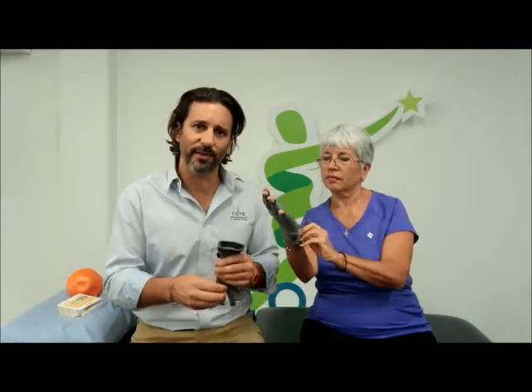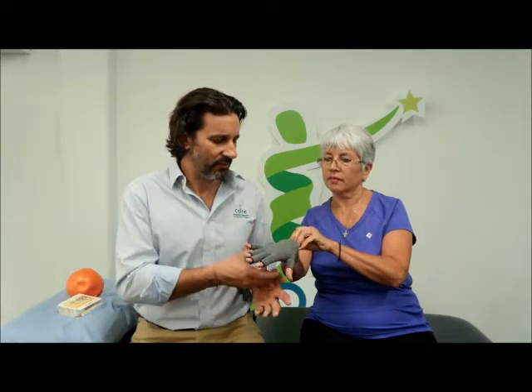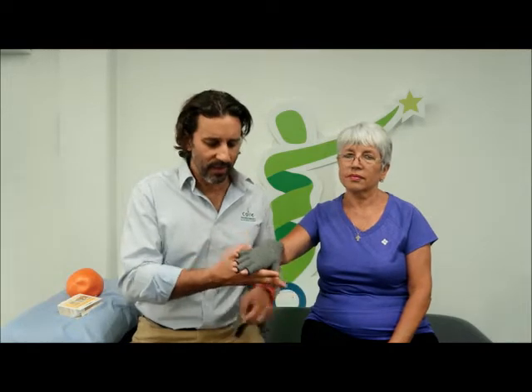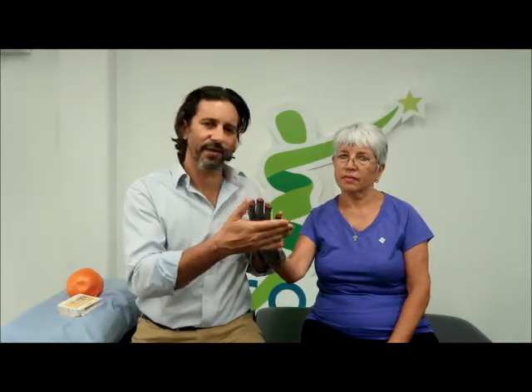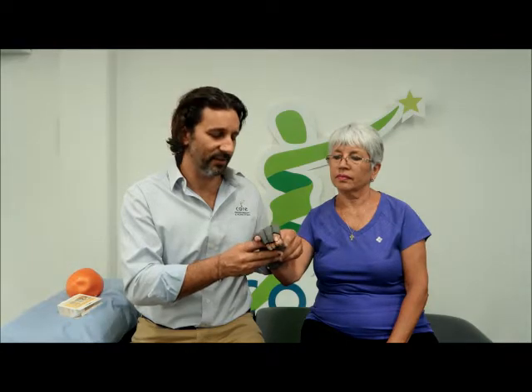You'll notice when Helen's putting it on that it is quite an effort to get your hand in. It is very tight and it is a compressive garment, and it's that tightness that gives you the support and compression around the joints to help stop swelling and also give you warmth. You can see too that it's a fingerless glove, so the fingers aren't there, which means that you can use your fingers to still feel things and your hand will still be able to work during your day-to-day activities.